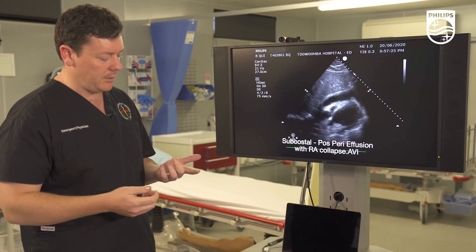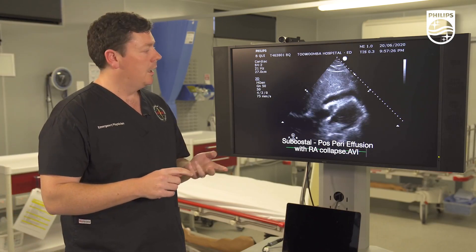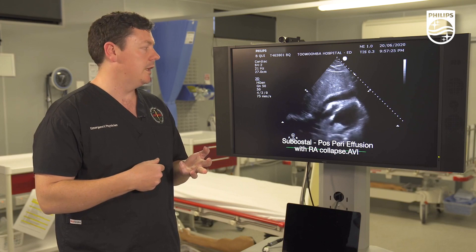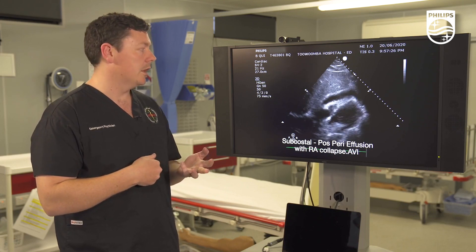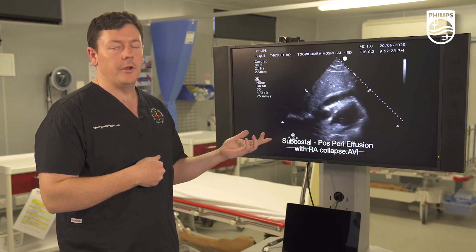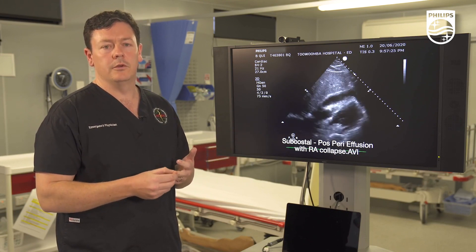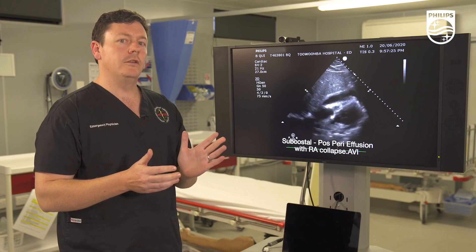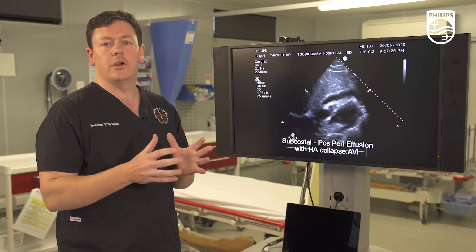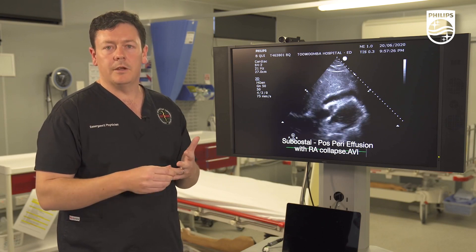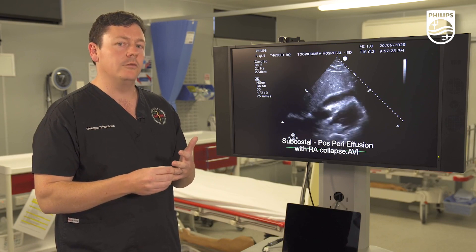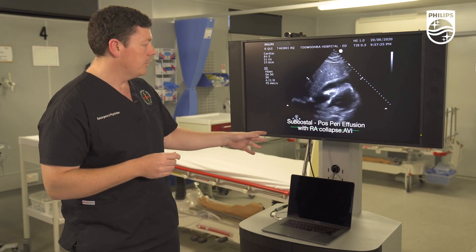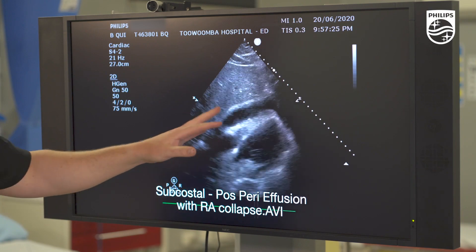The best windows for diagnosing pericardial effusion are your subcostal four chamber view, your apical four chamber view, and your IVC view. You get a good view subcostally even in cardiac arrest during CPR, and you can diagnose and demonstrate the size of the pericardial effusion. The apical four chamber gives a good look at the right ventricular free wall and the right atrium, which we use to diagnose intrapericardial pressure overload. The window here is a subcostal window looking at the pericardial effusion.